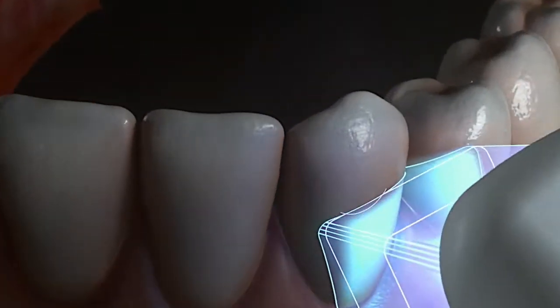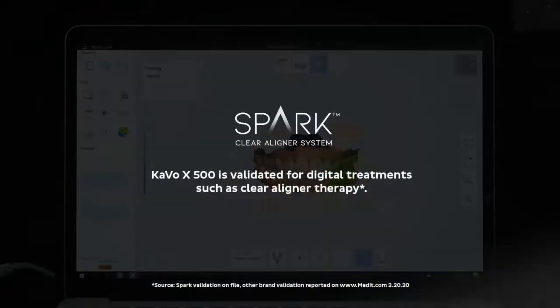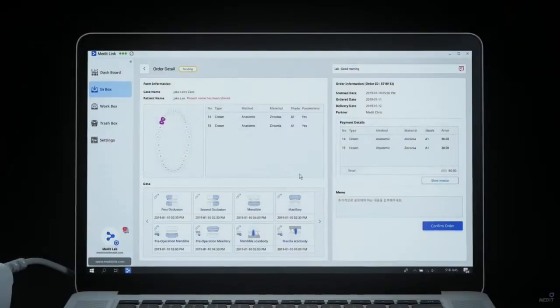The KaVo X500 is validated for digital treatments with a wide range of aligner and implant systems, most notably with the Ormco Spark Clear Aligners and the Nobel BioCare implant systems.